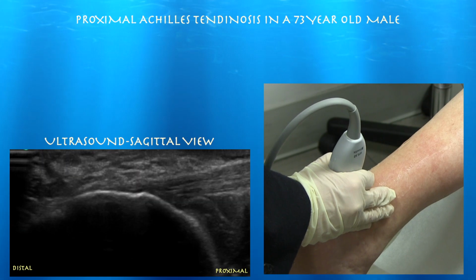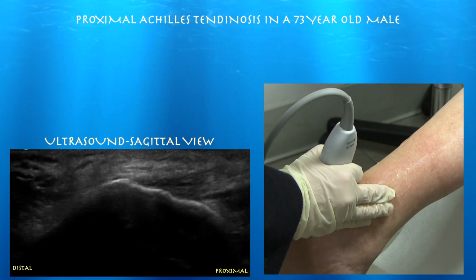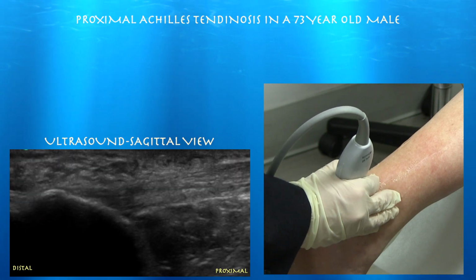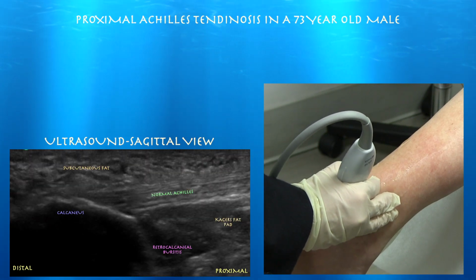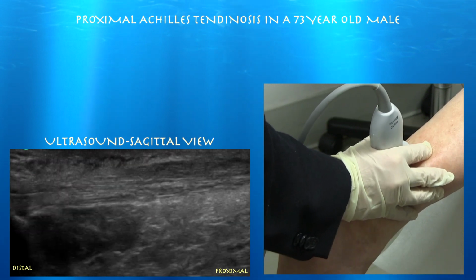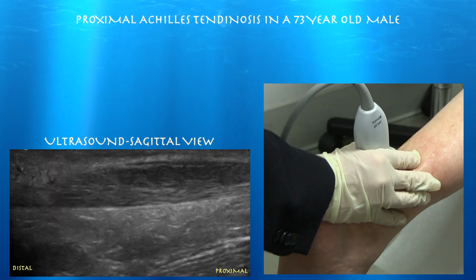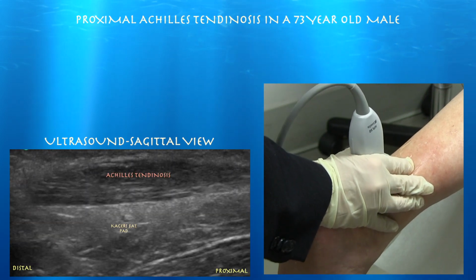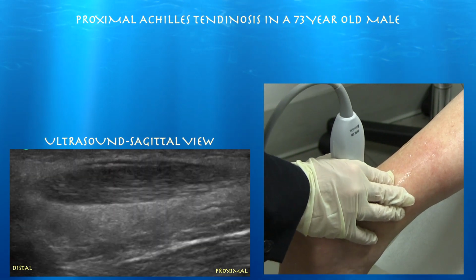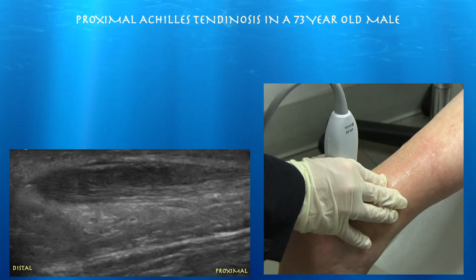Here's this distal Achilles tendon. Nothing major going on there. It does have some retrocalcaneal bursitis. And this, I believe, is just a minimal case of retrocalcaneal bursitis, as the bursa is just slightly enlarged. So I believe this is his main pain generator. If you just reviewed his MRI report, you wouldn't have picked up on this finding because it wasn't commented on. So this is one case where ultrasound can change your management.